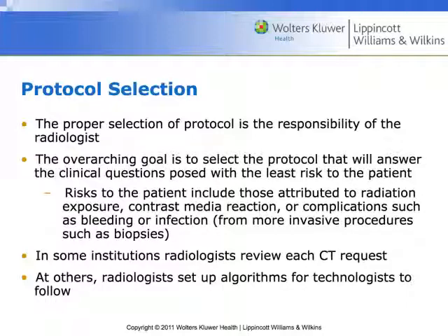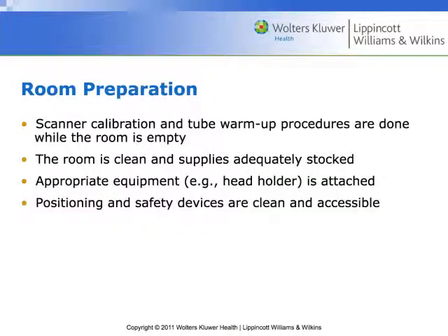Some places they want the radiologist to look at every request for a CT scan. This kind of goes without saying, make sure your rooms are clean. A lot of the stuff that we talked about last week, like people puking on us, barfing blood, enema tips flying across the room, all that kind of stuff, we got to put the kibosh on. The way you do that is just prep the hell out of your room to where it's ready for whatever crazy zombie attack might happen, right?